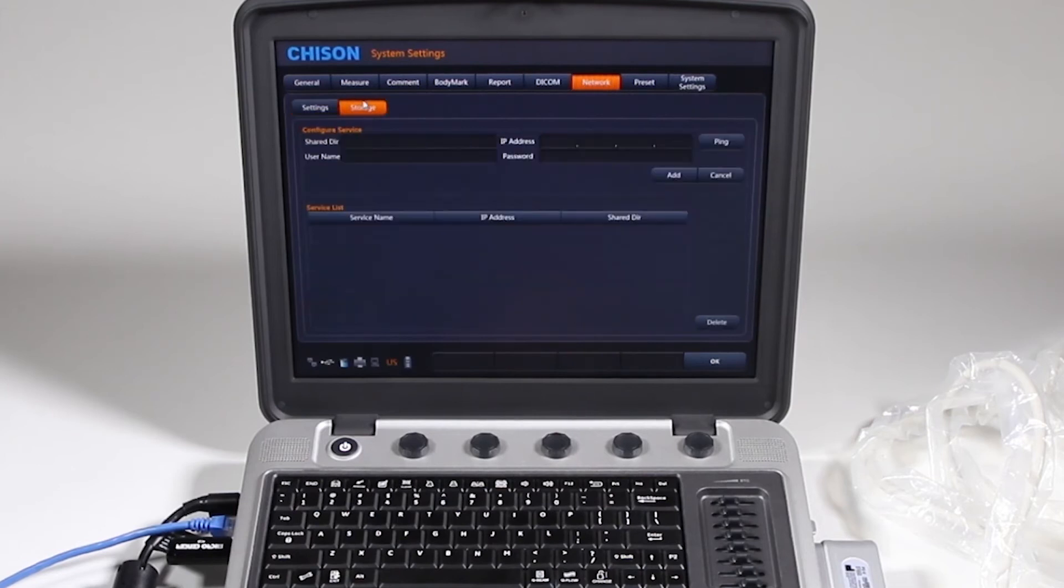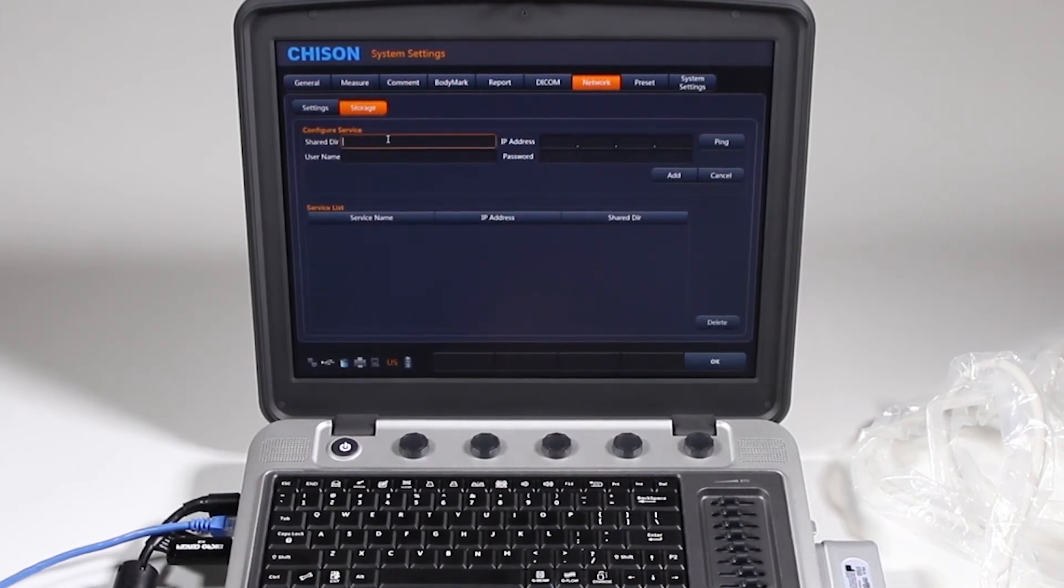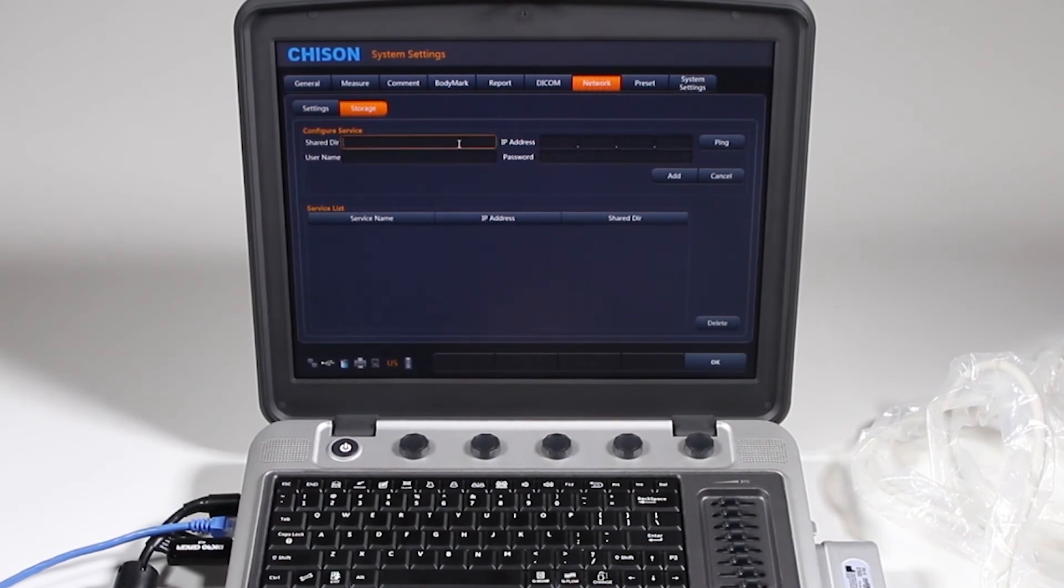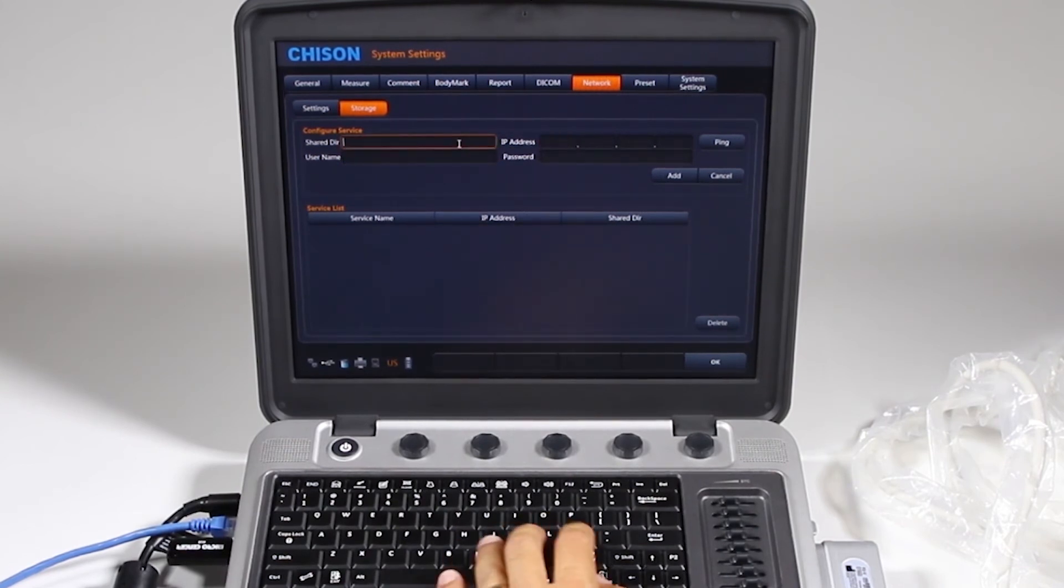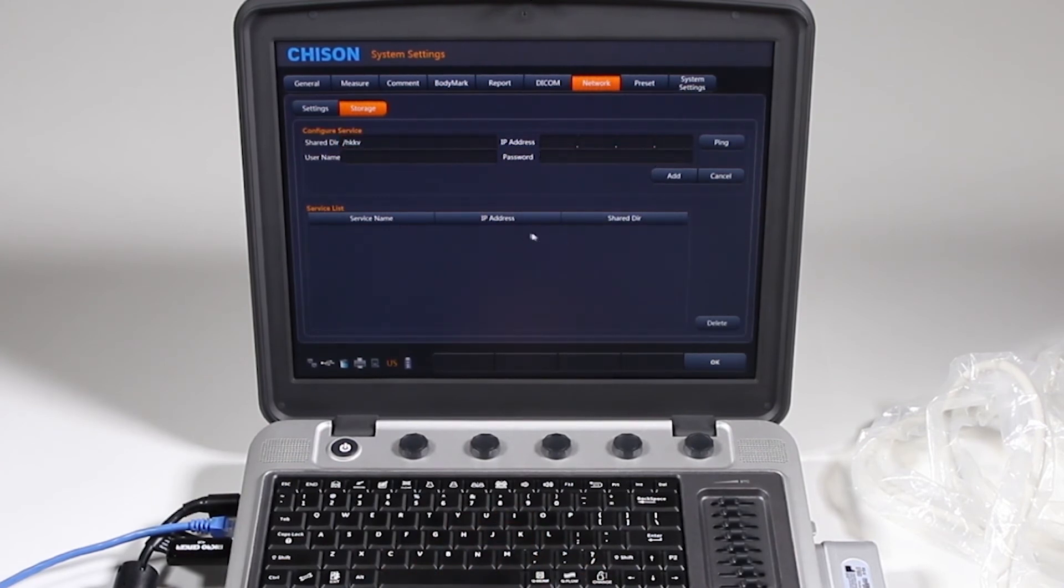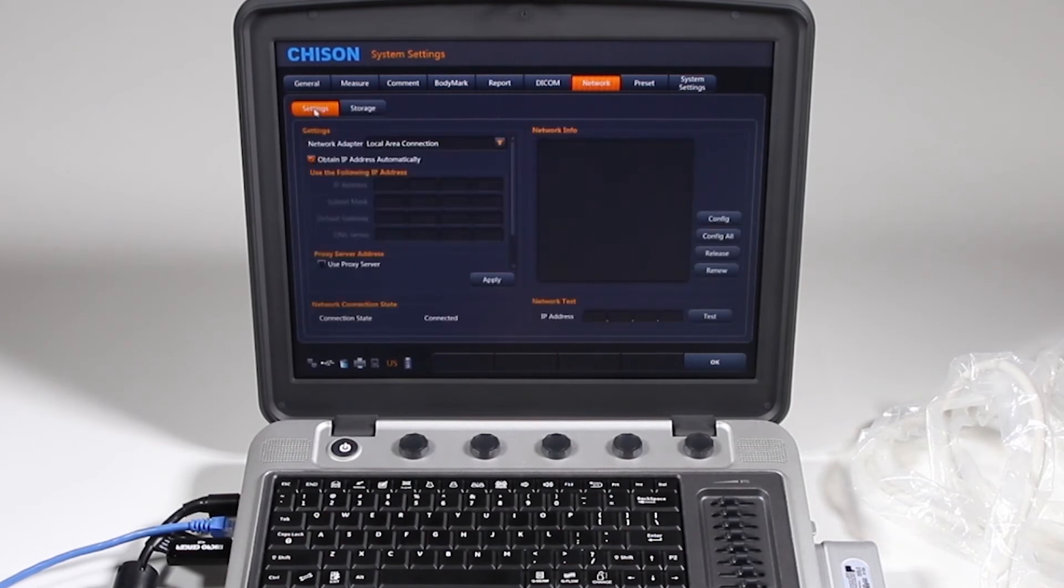If you have a network storage, you would also get this information from them. And really, it's just easiest if they give you that information and give you the shared directory names, and then you would just click add, and it will show up down there. Let's go back to the settings.